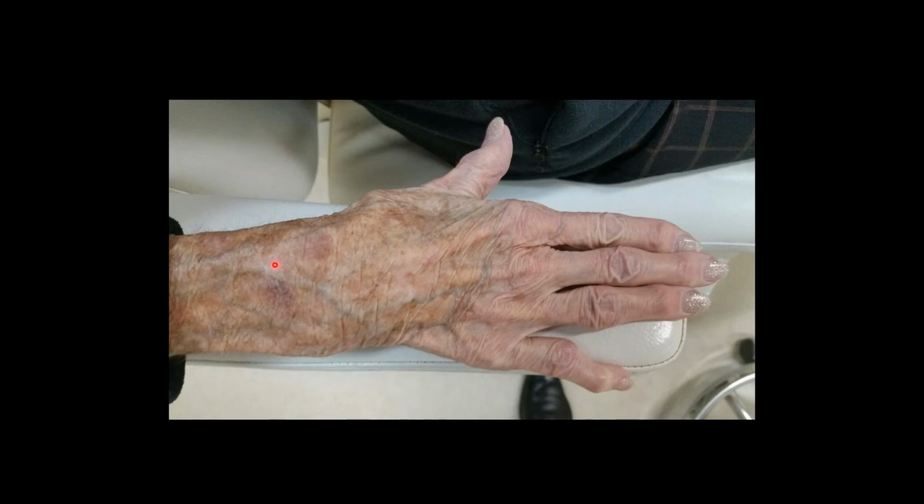If she's bruising, that means she can't handle hydraulics so well. So the dentures put hydraulics down on the ridge where the skin is probably thinning. Do you think she's going to be more susceptible to sores? Yep. And so now, are you going to open up that vertical as much as the textbook tells you to? Should you? These are questions you can ask and, again, try to customize, especially if you're in the weeds on a case.